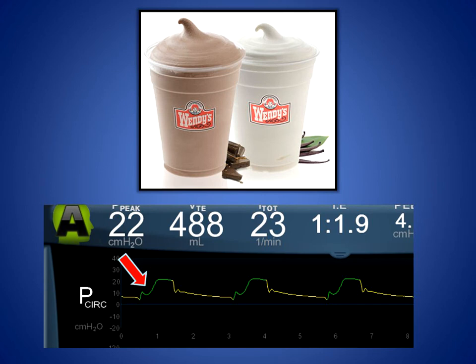And so you have a straw in the Frosty, and you go to try to take a drink of the Frosty. And you make the same effort that you would to take a breath to drink that Frosty. You make that effort. However, if you can picture this, you wouldn't be delivered the Frosty. It would not come up the straw. And your first knee-jerk reaction is to pull even harder, by the way. So we'll kind of put that in our back pocket for a little later and refer back to that.